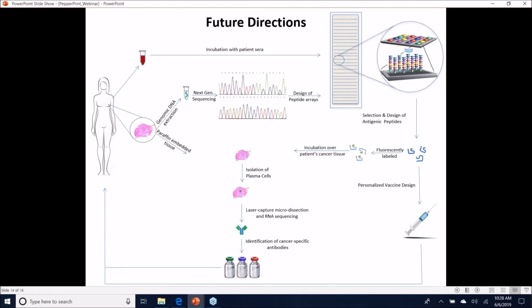Additionally, we're interested in potentially developing a diagnostic chip where patients can be monitored. For example, we discussed that in the paper. Essentially, we think these commonly mutated genes could provide a sense of how your immune system is working, especially in patients undergoing immunotherapy such as checkpoint inhibitors, whether or not they're responding. You can monitor details of antibody response in patients' blood. So that's some of the things that we're interested in.